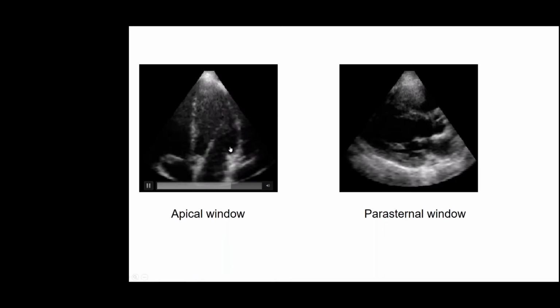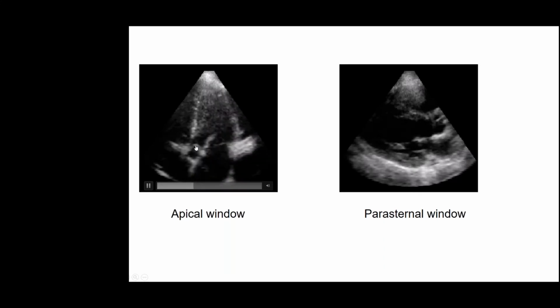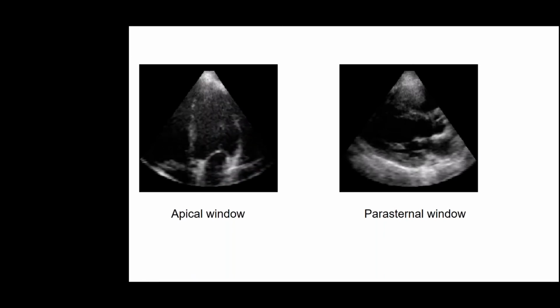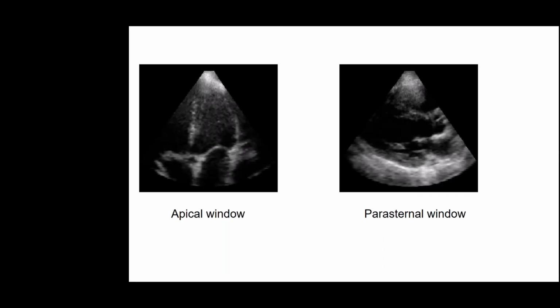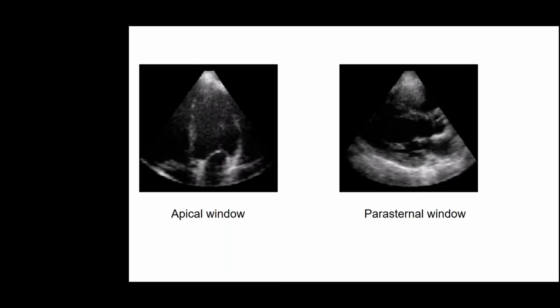Apart from that, the delineation of the cavities is a bit challenging because the quality of the surfaces is not as great as in other modalities, certainly not as good as in the CT image that we saw before. So the interpretation of these images requires a trained clinician to have some manual input. A lot of progress has been made in automated tracing, but it's still mostly a manual process in the clinic. And also there is significant inter-observer variability in the measuring of parameters from these images.